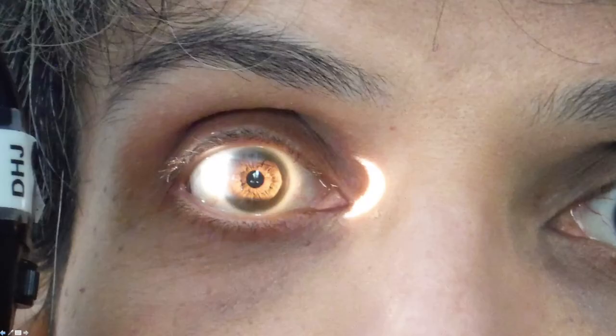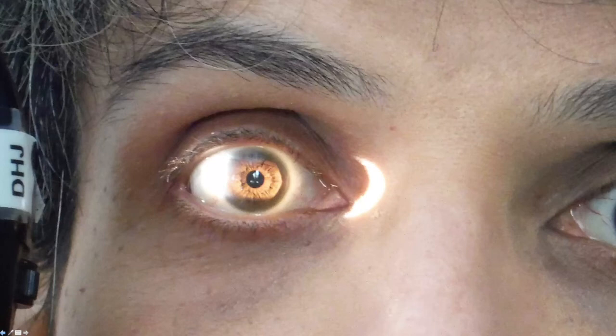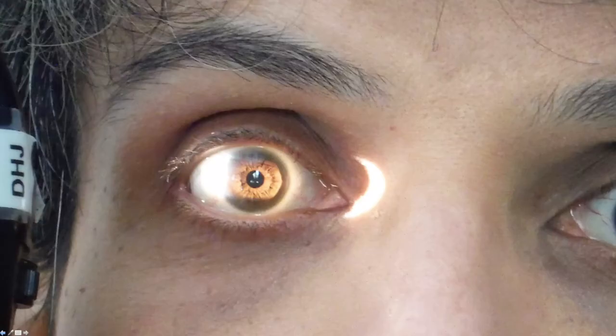If the iris is sitting too close to the cornea, then the slightest dilation — from, for instance, dilating eye drops — can stop the fluid flowing out of the eye and induce angle closure glaucoma.